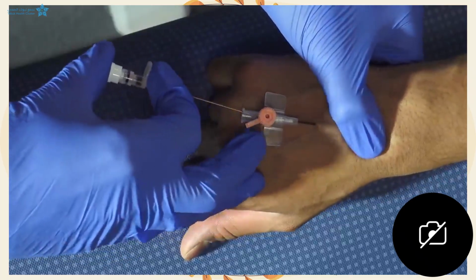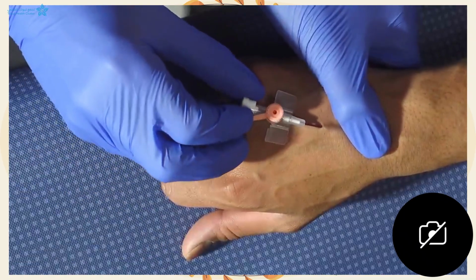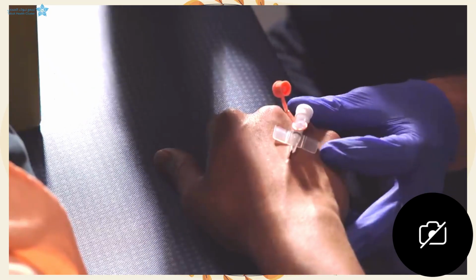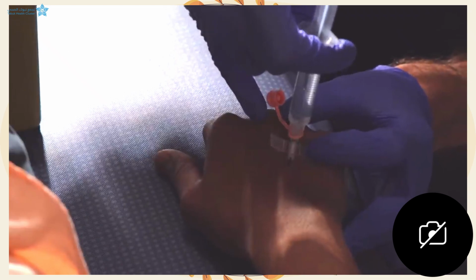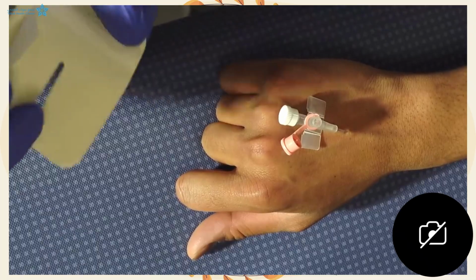As we pull the needle off, we're going to occlude the cannula so that we don't get any leakage, and we're going to apply the cap to the back of the cannula. Once this is in, we want to release the tourniquet, and then we're going to prepare our flush. So advance the cannula fully, put the flush to the cannula and flush. So we know that we've got an easy flush, so there's no problems.